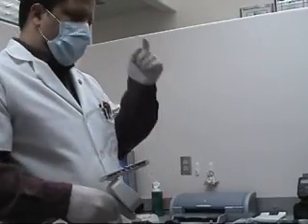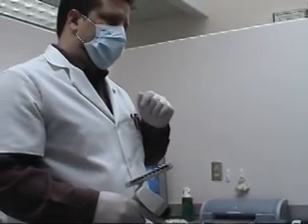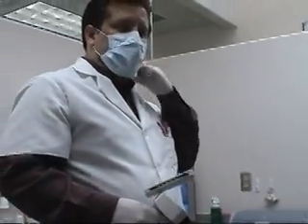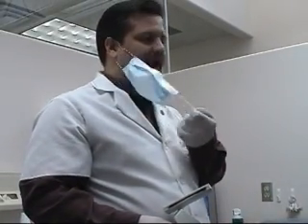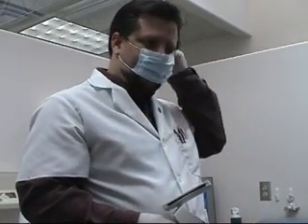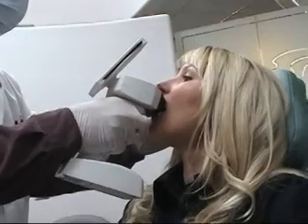Instruct the patient to open their mouth as wide as they comfortably can, breathe through their nose and touch the back of their throat with the tip of their tongue. Place the mouthpiece directly on the tooth with the uppermost edge touching the gum line.